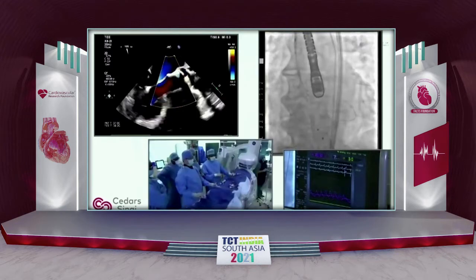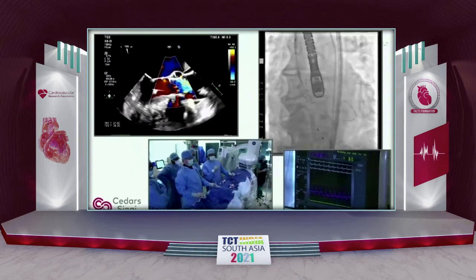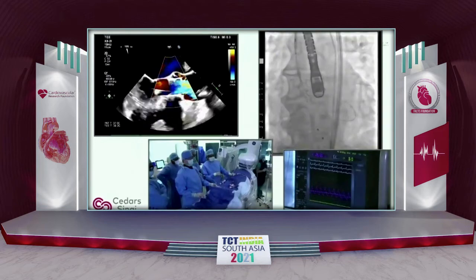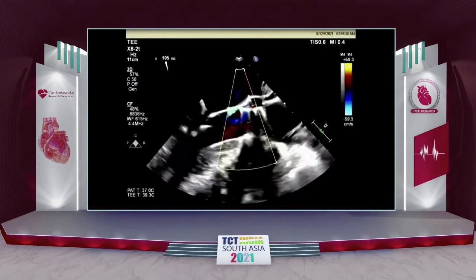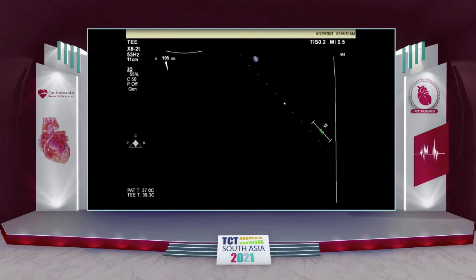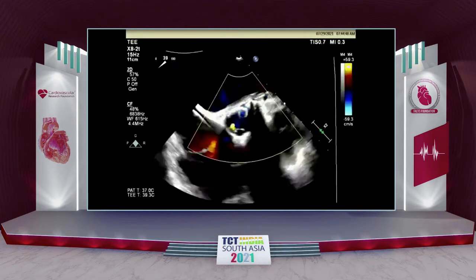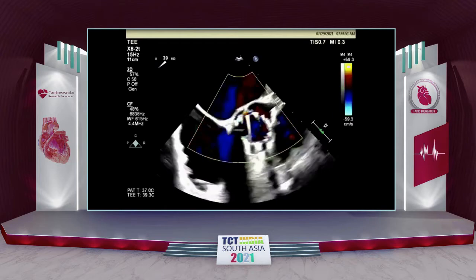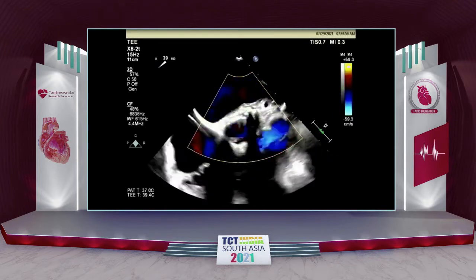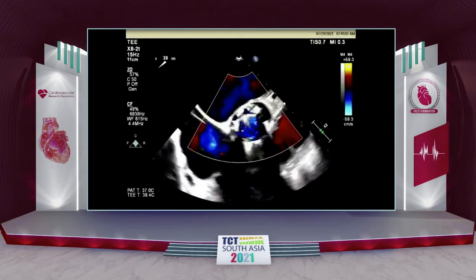So far, we see that there is a little bit of PV leak there. So the question is, there was a rod of LVOT calcium. I think this was one of the things that we had seen. Taking a look at this leak, it's very close to the commissure between the non and the left. I think that's where it's coming from. It's mild. But you gave all the volume, right?